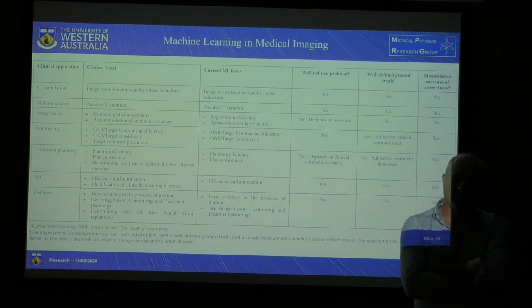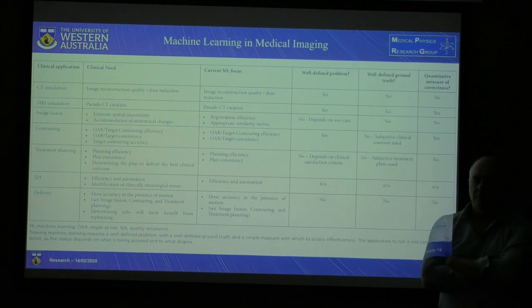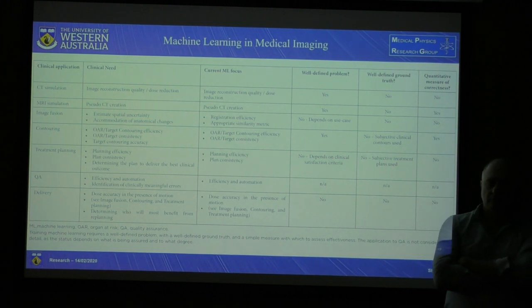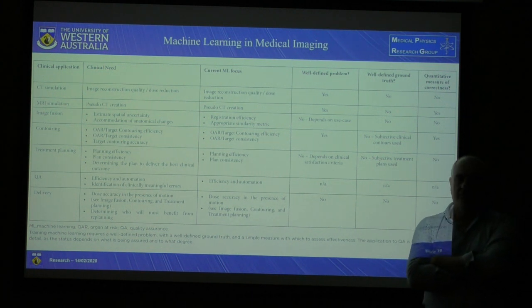I have a question about the CT and MRI. So you were talking about how they try to use MRI images to create CT images for planning. And when you talked about this study from Matteo, what was the surname? You said the patient received a CT and an MRI image in the cohort. So did they try to create the CT images from the MRI images, and use the initial CT to compare? Yeah, that's exactly what they did.